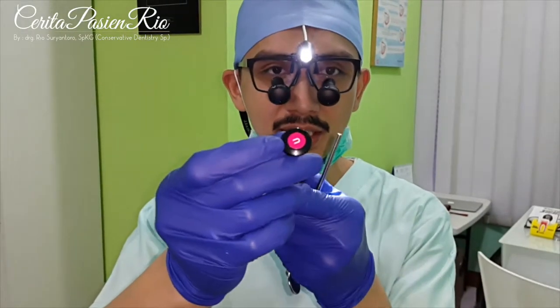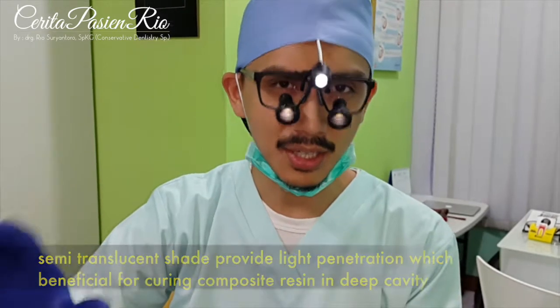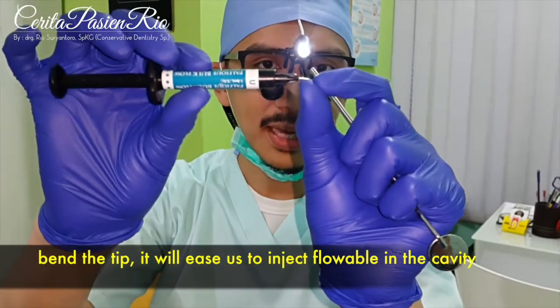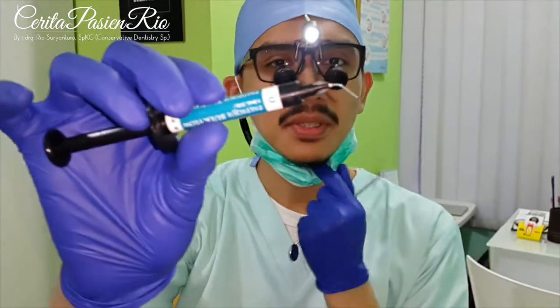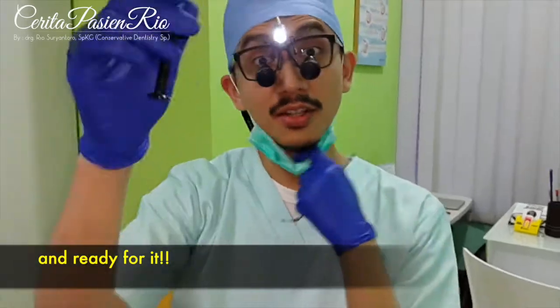I use this universal shade so that the color is a little bit translucent. First of all, we can bend these tips like this. Bend the tips and go to the KPD. So, let's see this.